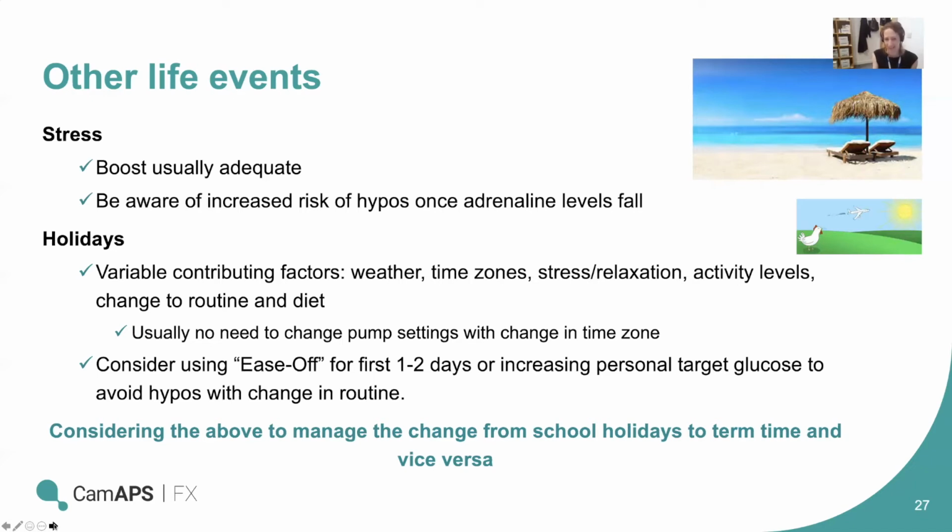dramatically. And I think this is, I know Sarah's had lots of calls about this when lots of the children at school have returned to school, and the differences between holiday and term time in terms of their routine, their activity levels, their concentration in lessons, and switching between those two. Again, just thinking for the first couple of days of each transition, really easing off on the system to avoid hypos, which I think can be really detrimental as you swing from one thing to the other.